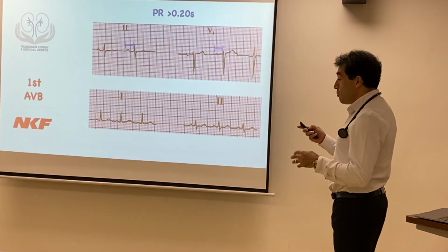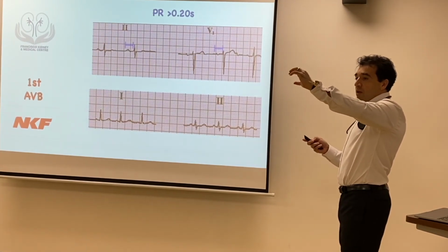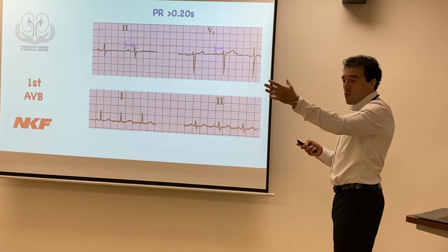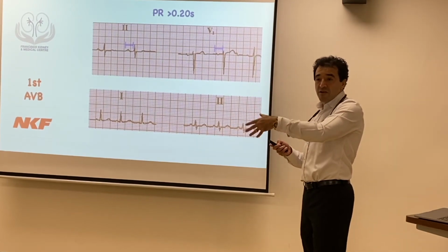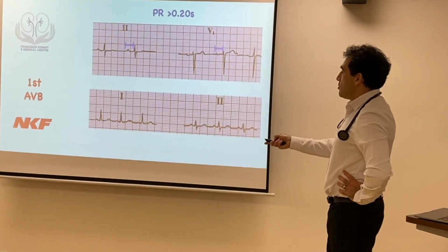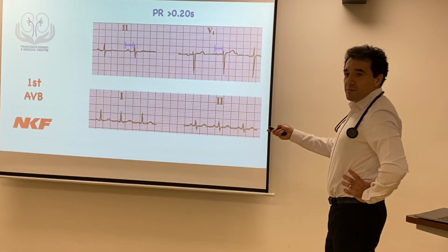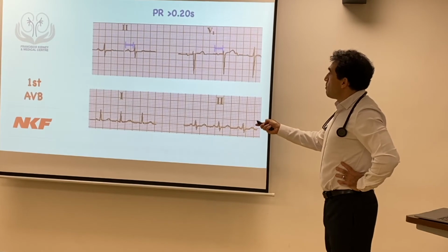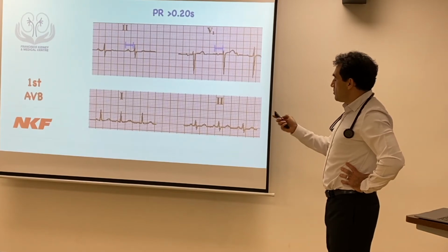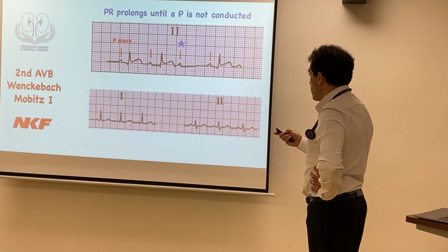We already mentioned some blocks on the sinus node. Then remember the impulse goes into the atrioventricular node, the AV node. So the impulse can be blocked there too. What is next is the conduction to the ventricles. It will also be impaired, and that is what is called the AV block. There are many degrees. The first degree AV block is very common, especially in people on beta blockers. You see that the PR interval is prolonged, more than one large square. And the patient might have tachycardia, or bradycardia as well.